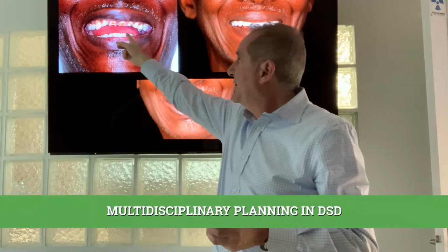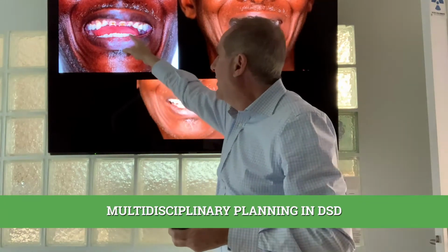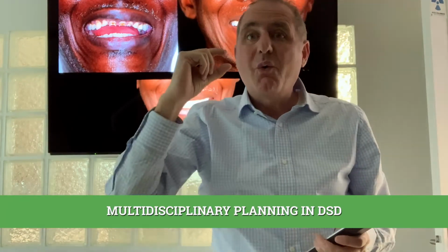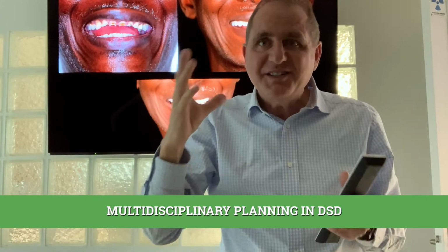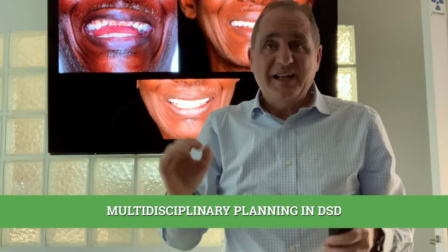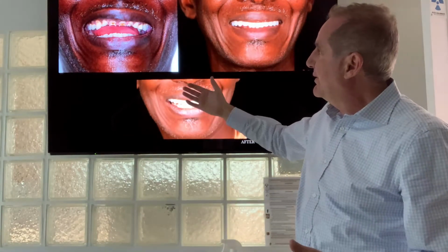So this is only an example just to show you digitally. This oral rehabilitation, upper and lower, was done in 1 day. Look at the patient, how severe the abrasion was here, and even the occlusal plane was down here. So there is a lot of lost vertical dimension. Sometimes the patient can give you 1 centimeter of height. Imagine this, and I promise you that when they close, it is fantastic. And when they swallow, the next day they feel so nice and relaxed and good. So see the final outcome, how we really gain the height and can provide the best.